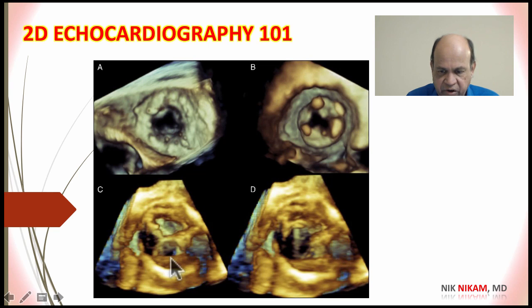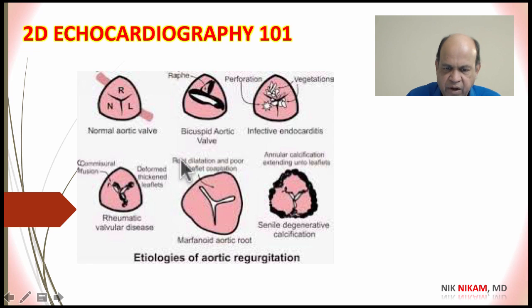And here's a pathological example of how aortic leaflets look. There's a lot of calcification, thickening, fibrosis, and adhesions, which represents aortic stenosis. Let's move on. Another condition that we will encounter frequently using echocardiography is to identify patients with the bicuspid aortic valve.